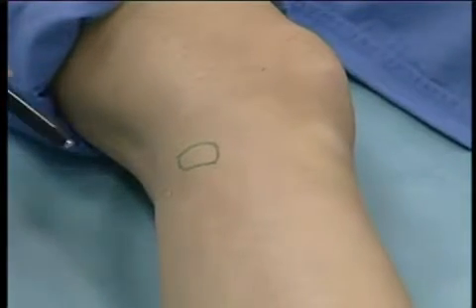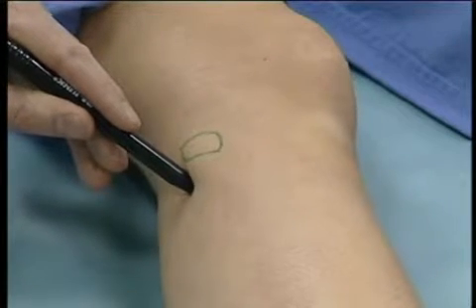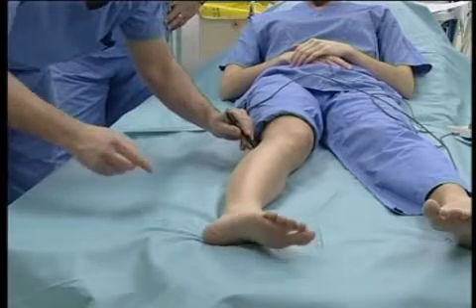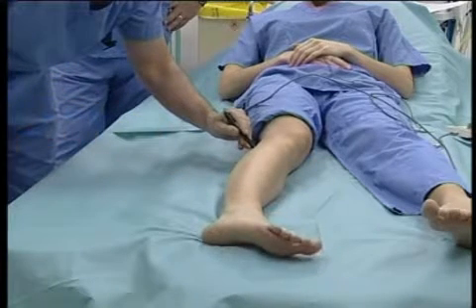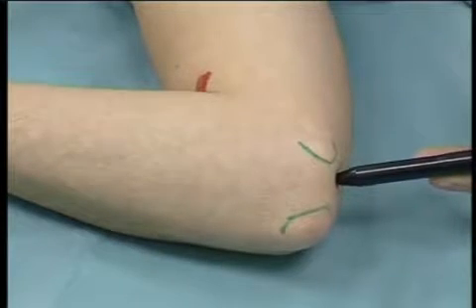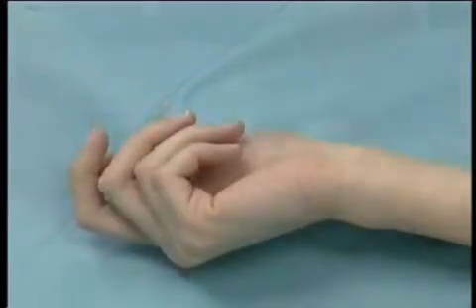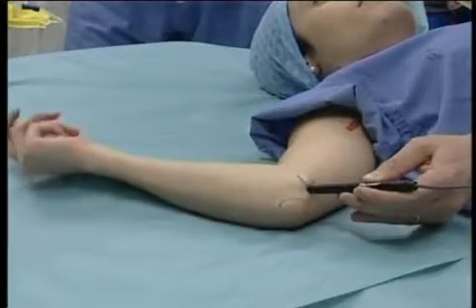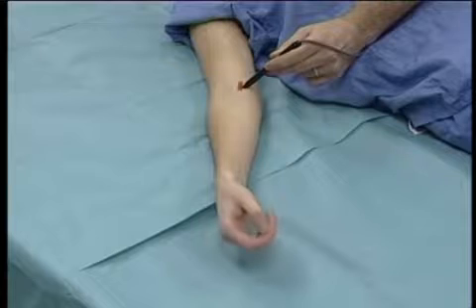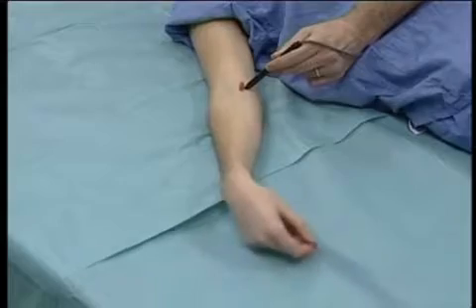To locate most of the peripheral nerves, only light pressure need be applied to the skin surface, to which has been applied a water-based lubricant. The PEG is moved over the skin surface until paresthesia or a motor response is elicited. Transcutaneous electrical stimulation to elicit motor or sensory response is used to assist identification on the skin for needle insertion during peripheral nerve blockade. Pre-location of the nerve could therefore be useful in reducing pain, as the procedure reduces exploration time with the needle and improves precise location of nerve position during the block.